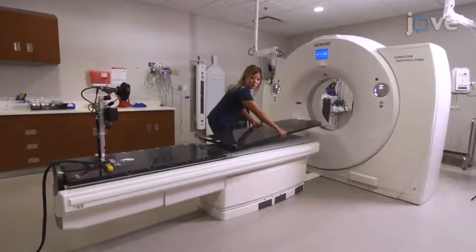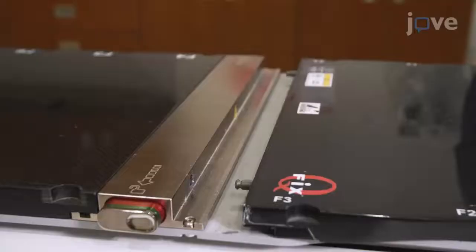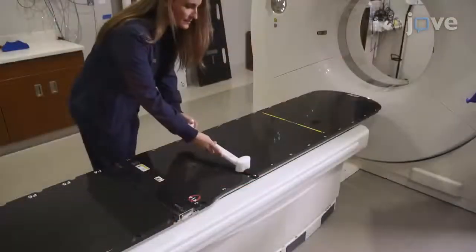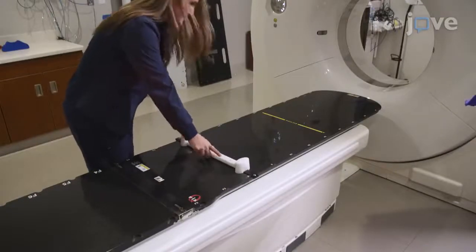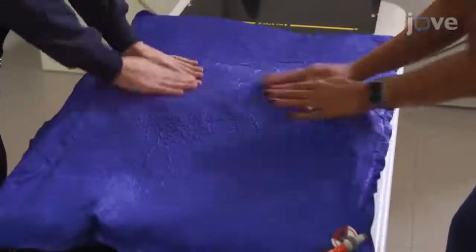Before beginning the simulation, insert the extended tabletop into the treatment table and ensure that it is locked. Place an inflated immobilization cushion over the tabletop and the indexing bar for the leg mold at the level of the patient's knee.